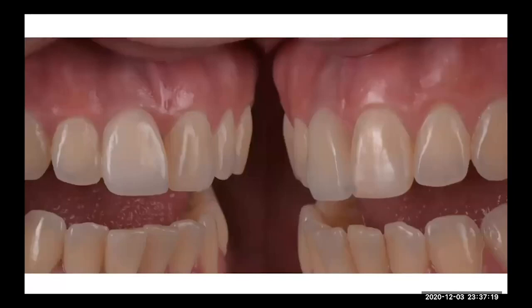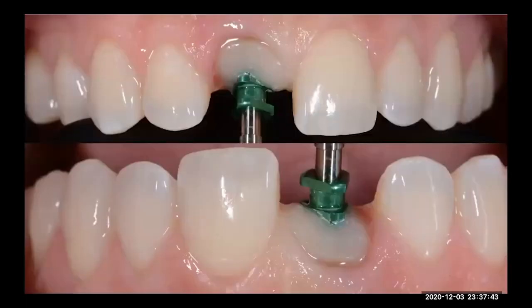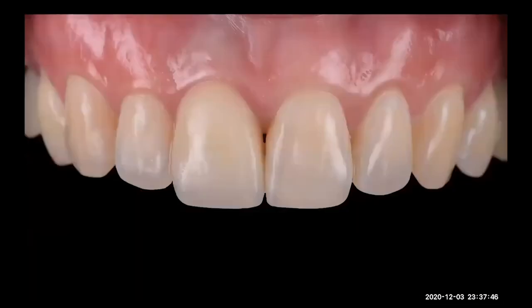And this is the try-in of the crown. You see, it's a little bit light. So in that way we confirm that the picture he took was wrong, because sometimes the colors get down in chroma half a shade or one shade. So we need to be careful with that when we take colors. So this is our final crown later on. And you see the gum level is a little bit high, but if you pick the right ingot, and do a nice stratification technique, you can get really, really close to the natural teeth, okay?